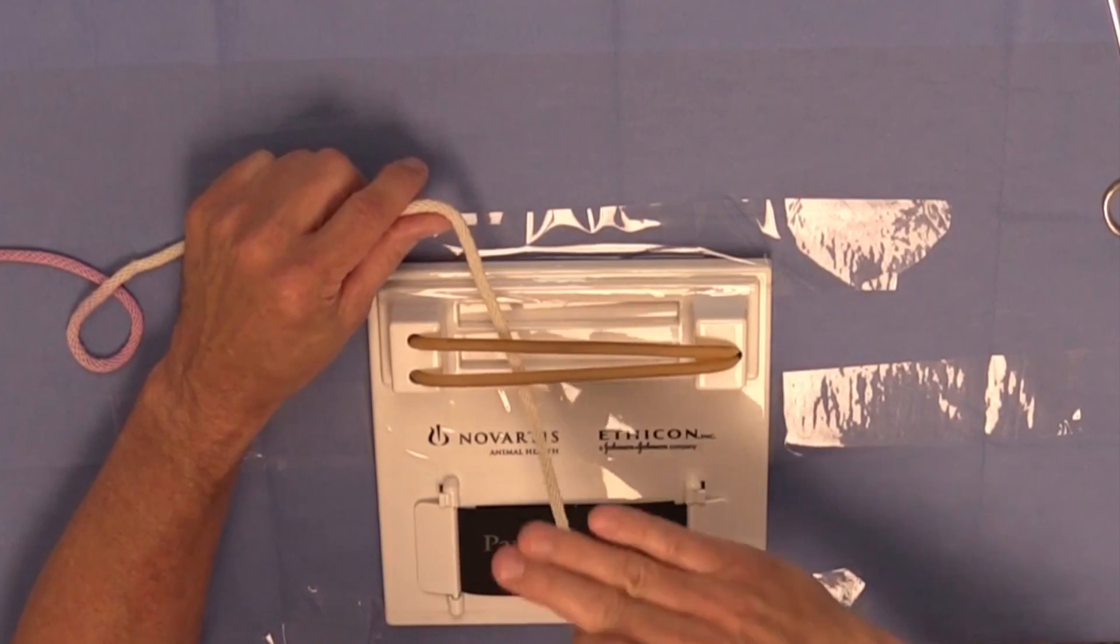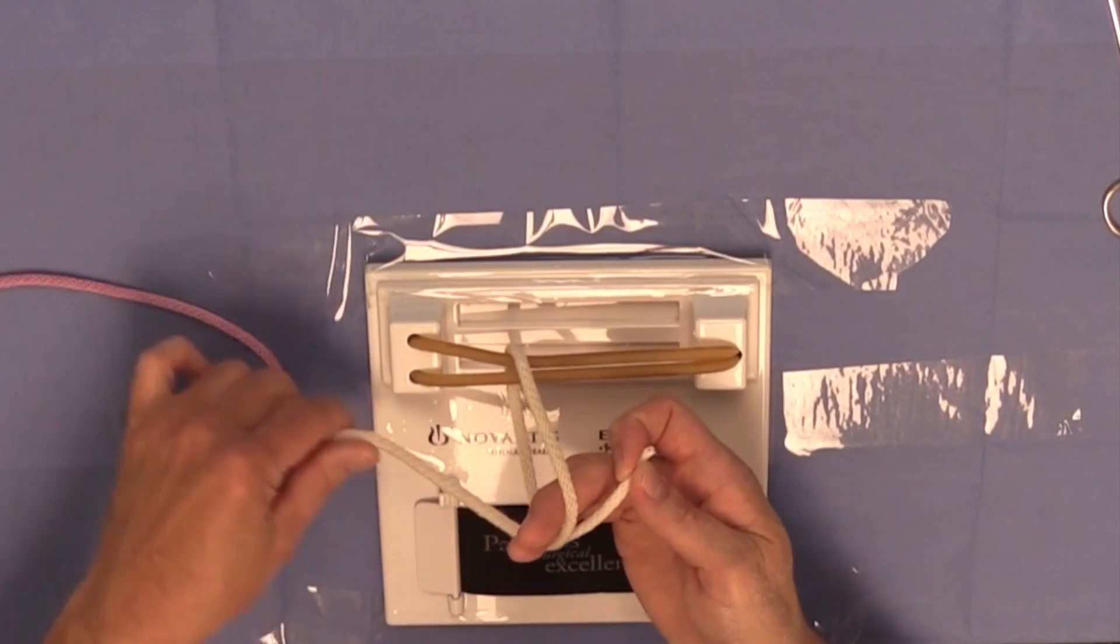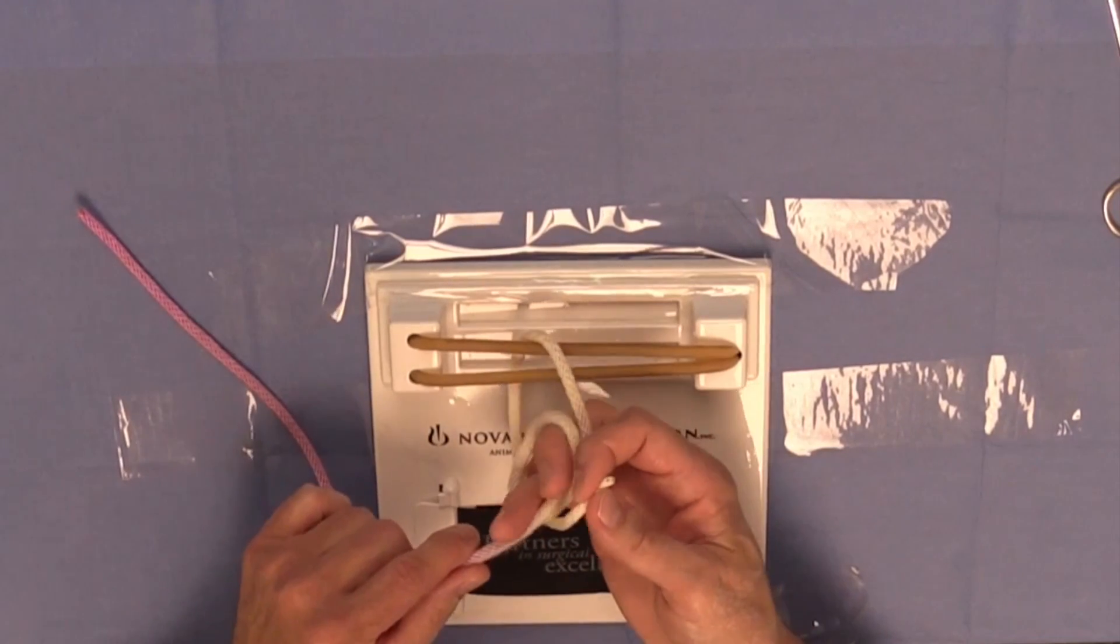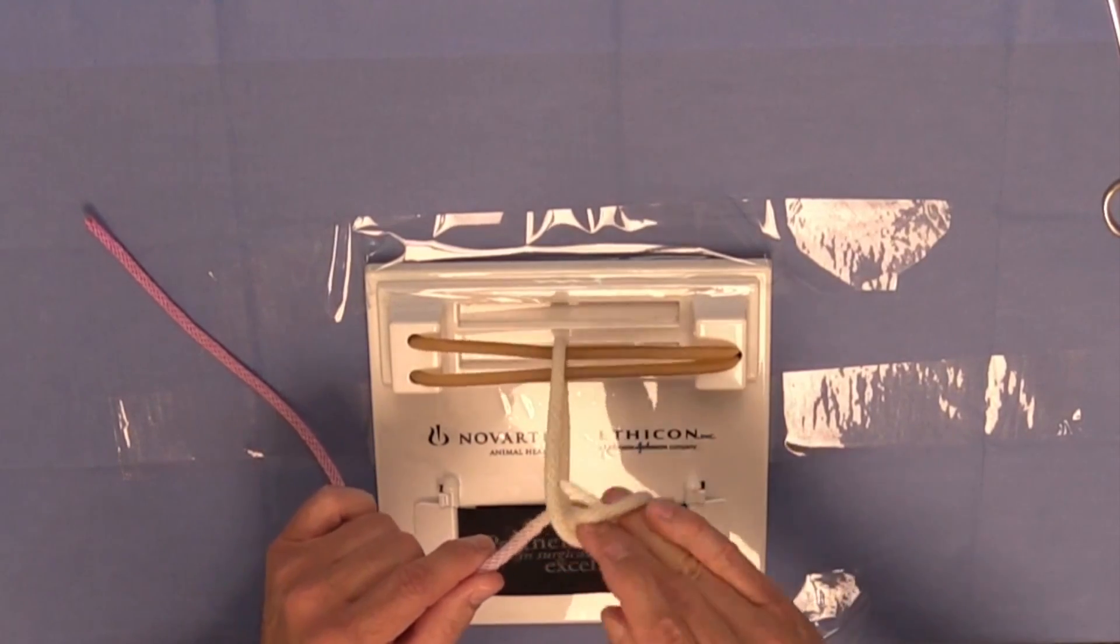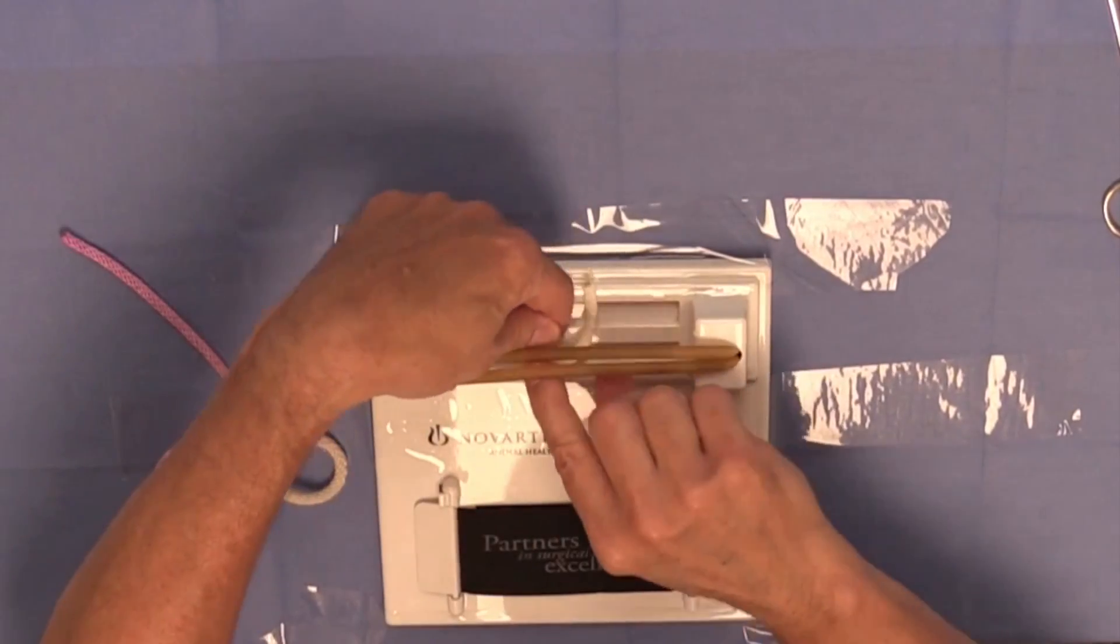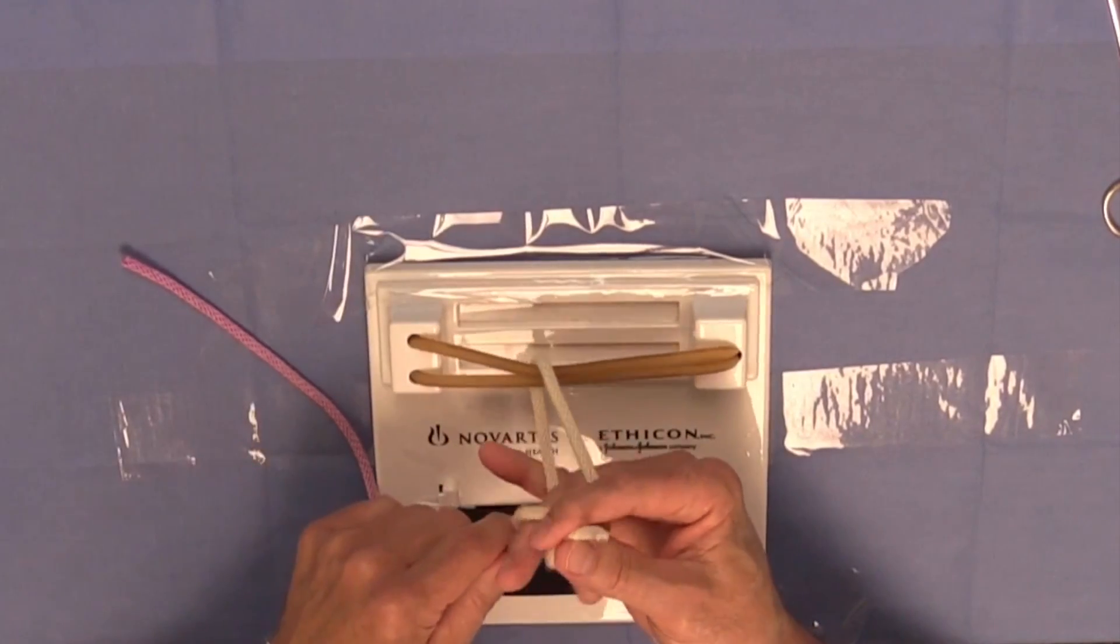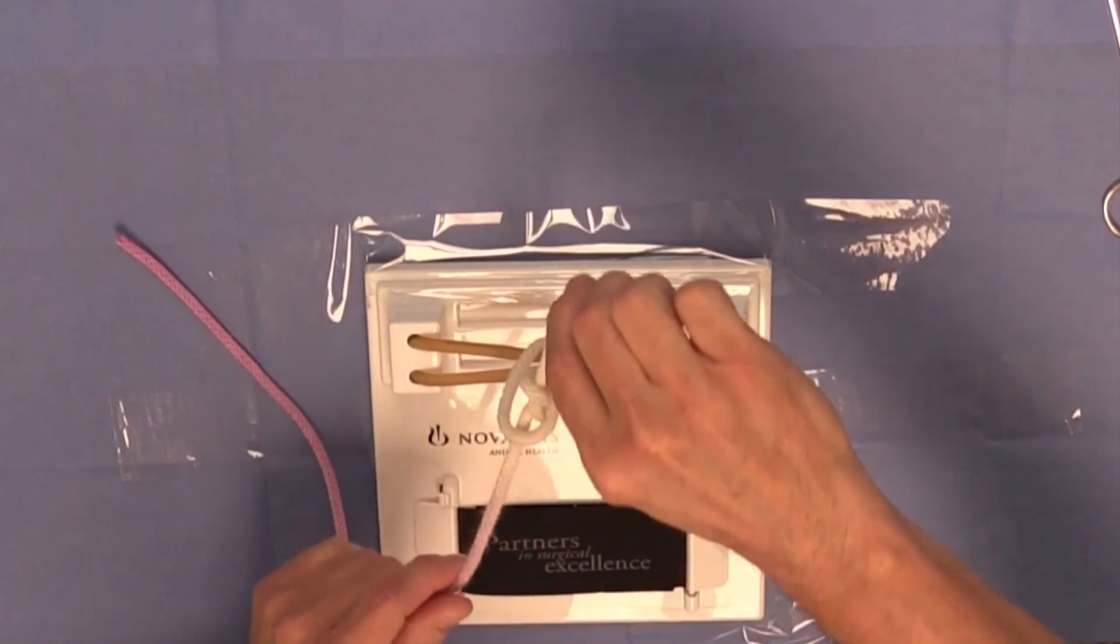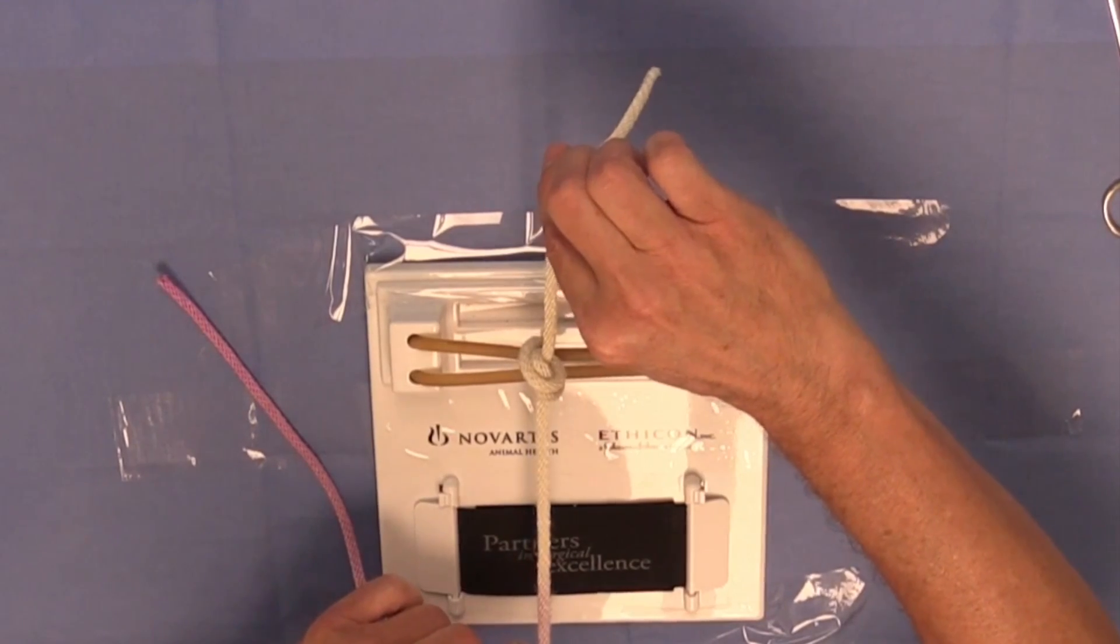What I'll do is I'll create the half a loop, and then I'm going to go around my two fingers twice. Now, this becomes somewhat cumbersome, because as you trap that end of the suture and go back through, oftentimes you get stuck like that. So that's why this is probably not the best technique, but we'll try it again, and I'm going to grab that and try to go through and eventually maneuver myself to the other side or halfway through the suture.